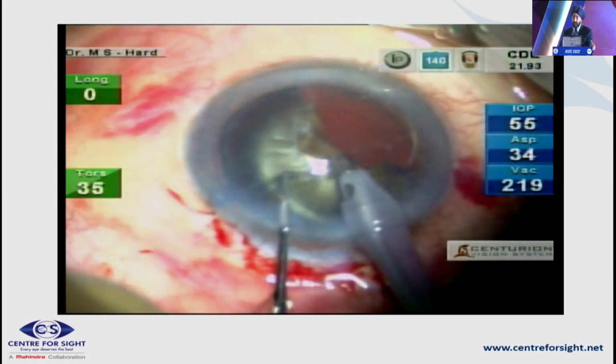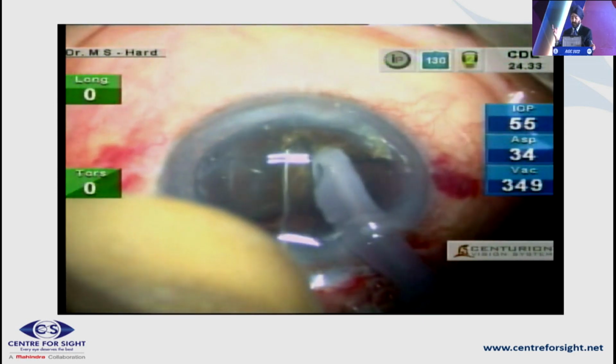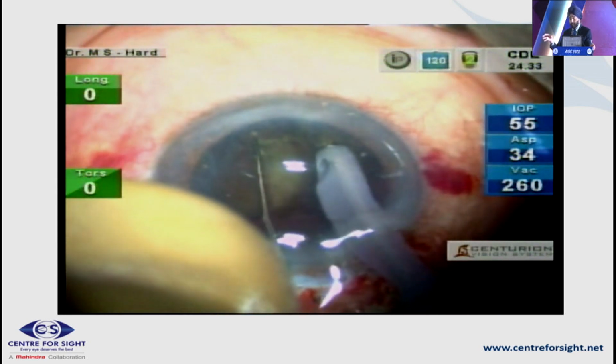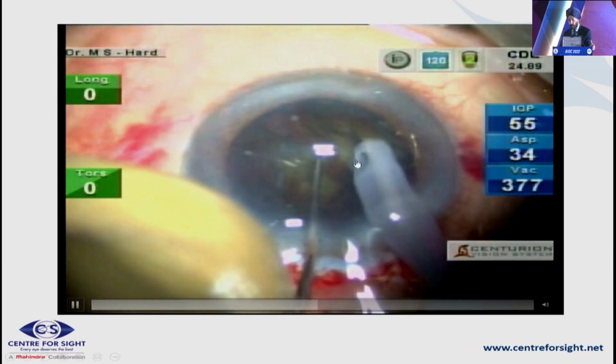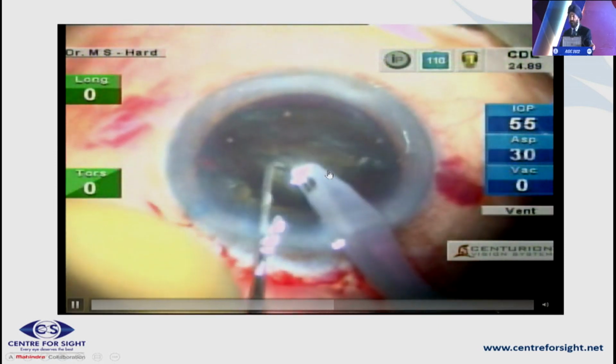Understood? Now you can see there is no epinuclear cushion, so you need to put viscoelastic, Viscoat, that we have put. And again, you can see I'm chopping from the center. Hold it deep, bury deep, go to 80-90% of the depth, and again wait till you have the chopper separate the nucleus right till the backbone of the nucleus.